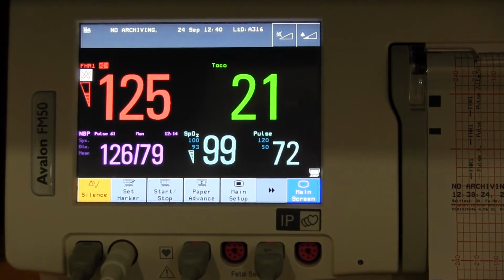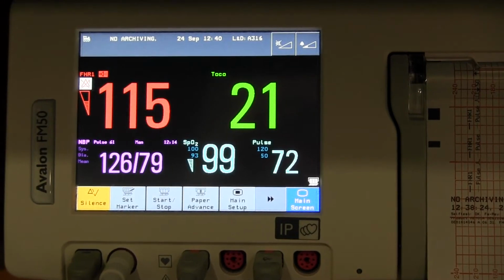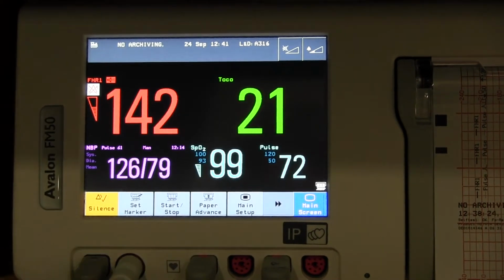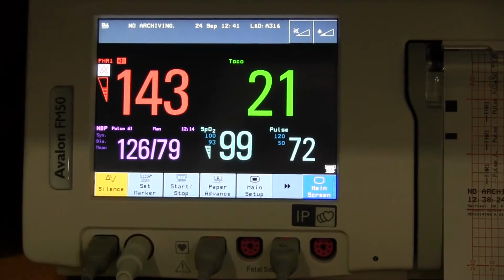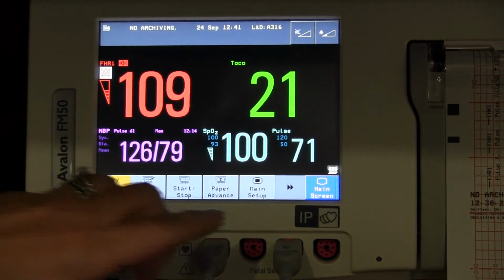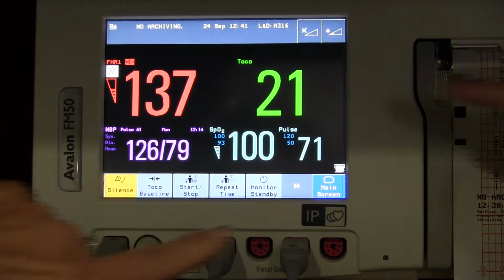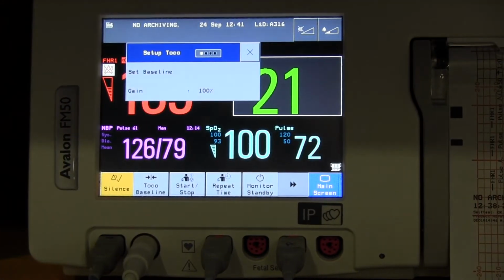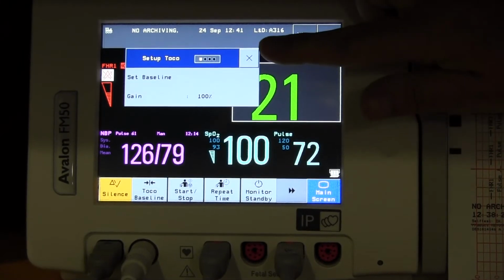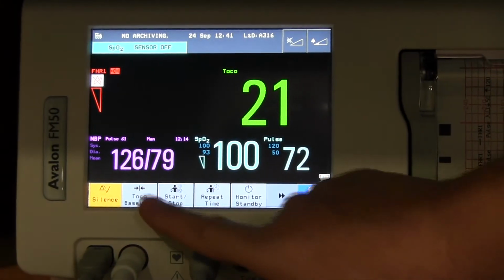To monitor uterine activity, connect the TOCO transducer into any of the 4 fetal sensor sockets. To open the Setup TOCO menu, select the TOCO number. You will notice that the location of the sensor socket is displayed. Press the TOCO baseline smart key to reset the TOCO baseline to 20.